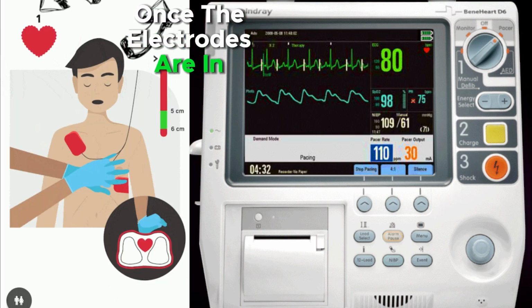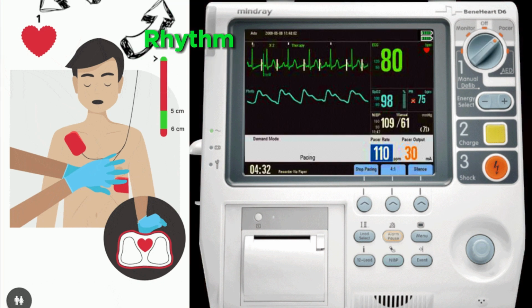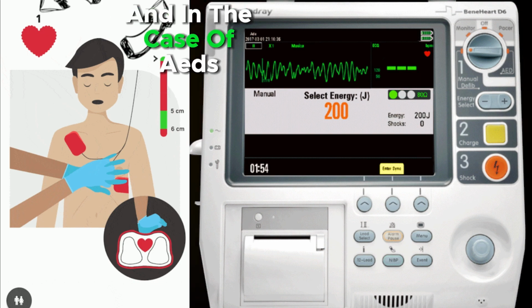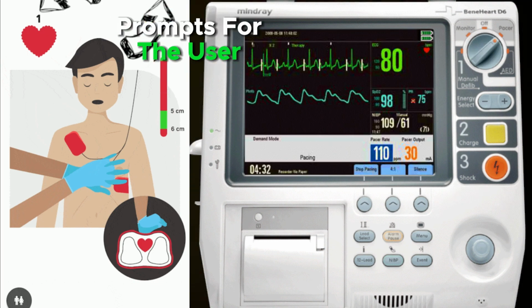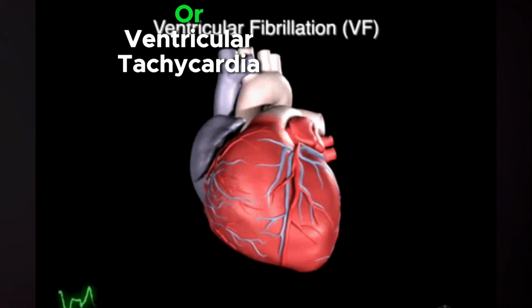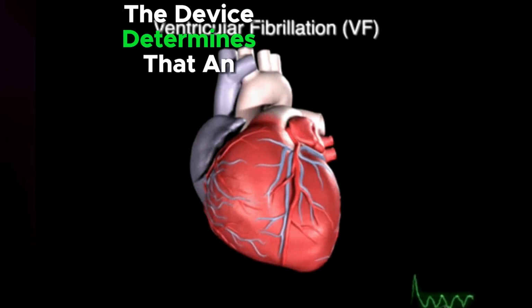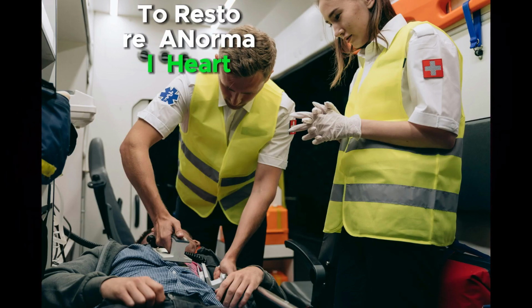Once the electrodes are in place, the defibrillator analyzes the patient's heart rhythm. This is usually done automatically by the device, and in the case of AEDs, it often involves audible prompts for the user. Defibrillators are programmed to recognize shockable rhythms such as ventricular fibrillation or ventricular tachycardia. In these cases, the device determines that an electric shock is necessary to restore a normal heart rhythm.